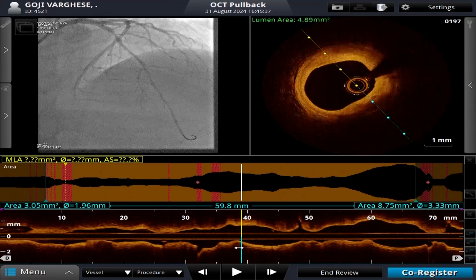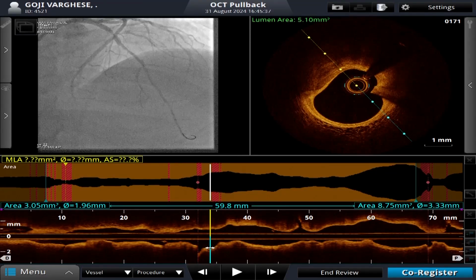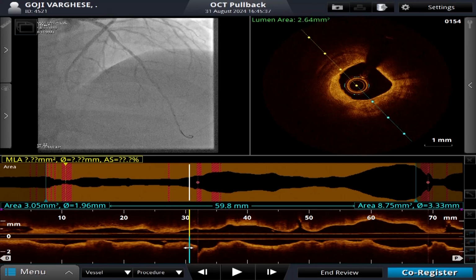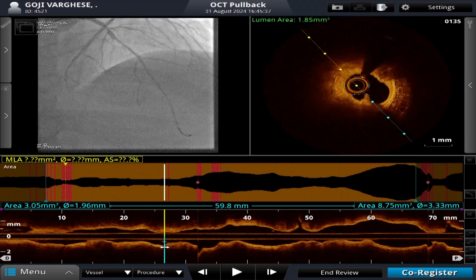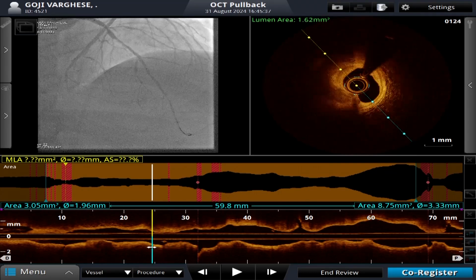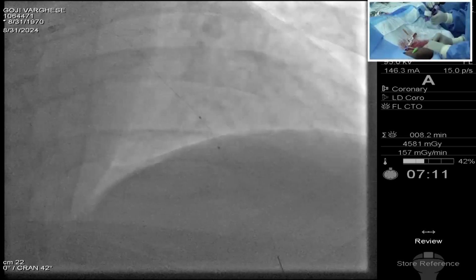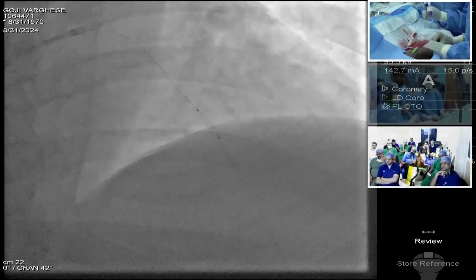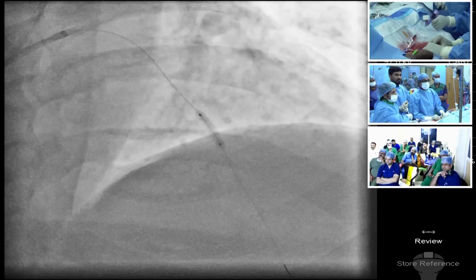Yes, there we'll go. But usually, we dilated it or? We dilated across the diagonal, the place where the balloon is. Here, we'll once again dilate it there, 14, 16, 18. 2.75 negative.